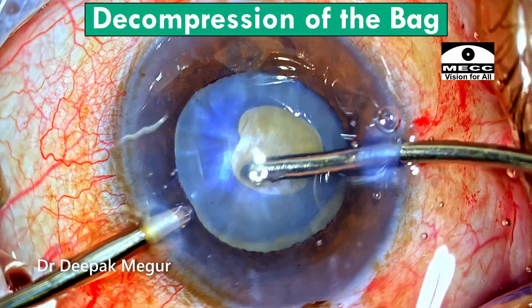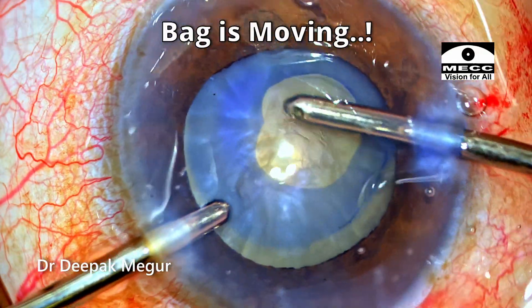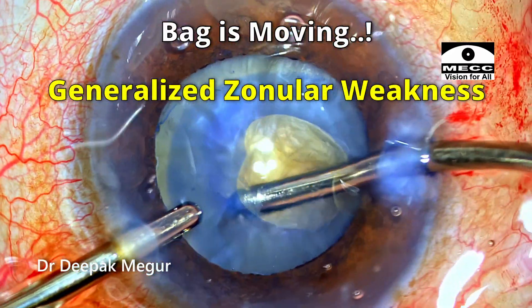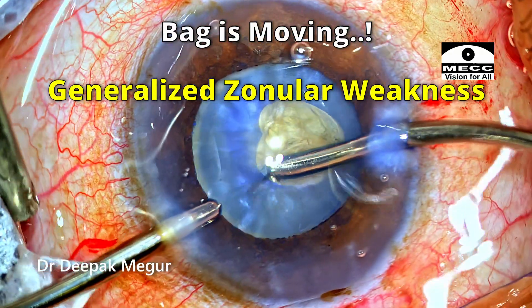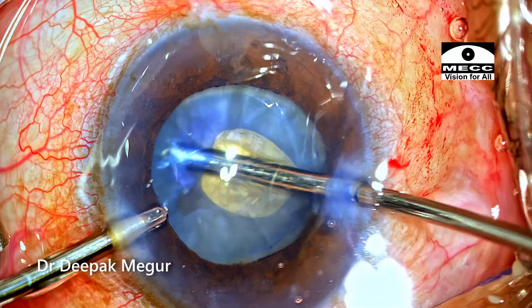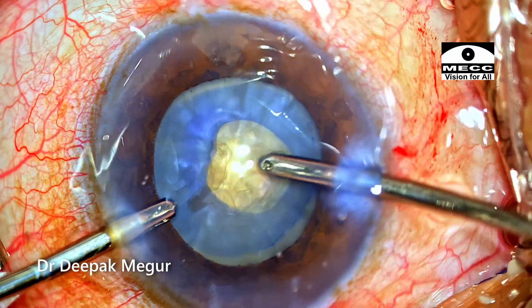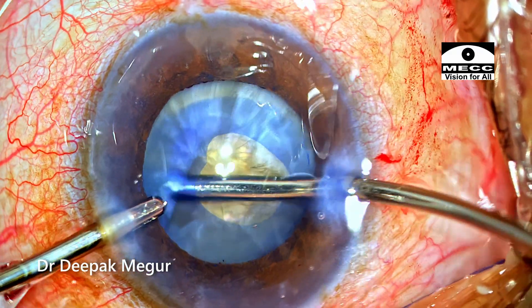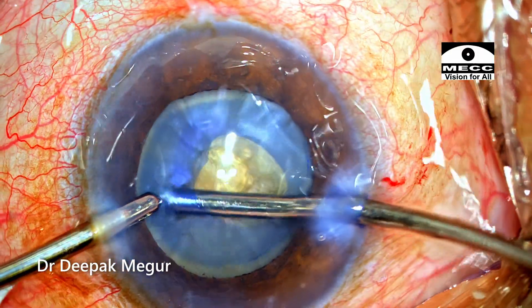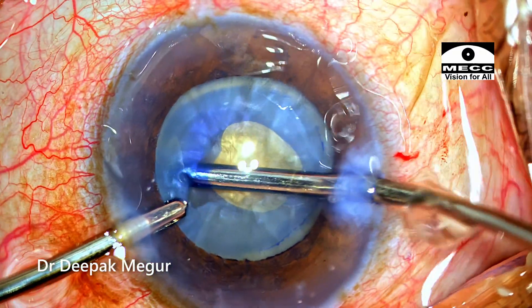I am going to use a bimanual irrigation-aspiration cannula. One can clearly see that the bag also has a tendency to move along with the nucleus — clear evidence of generalized zonular weakness. I am not using my phaco tip, my preferred method in this situation, simply because the capsular opening is very small and I don't want to inadvertently damage the margins. I am very careful not to tug at the anterior capsular edges, as these capsules are very thin, flimsy, and vulnerable to tearing.